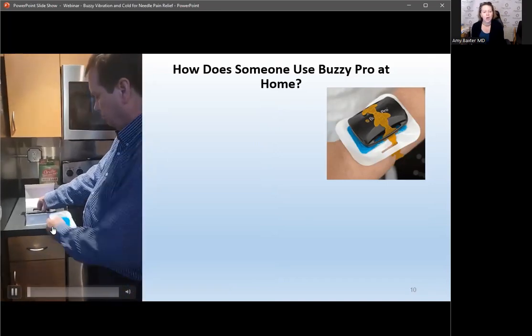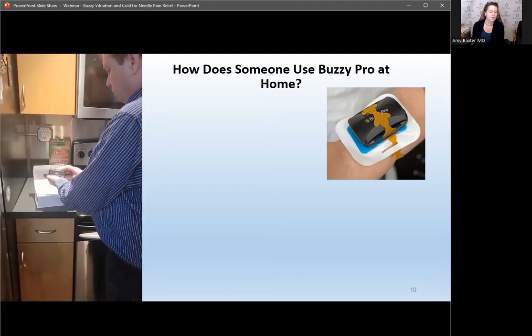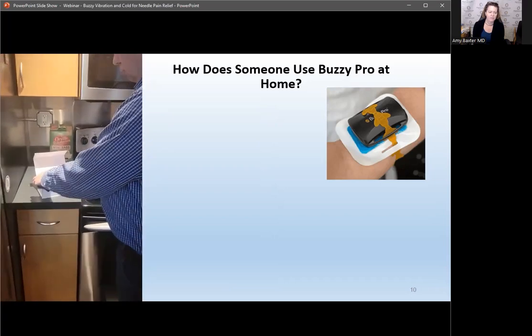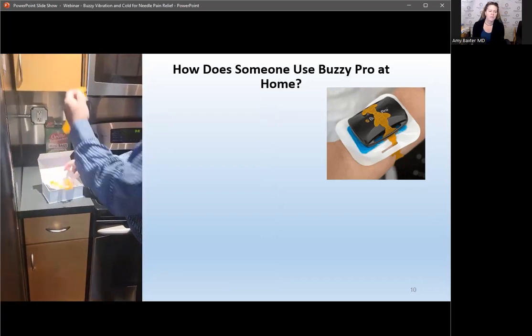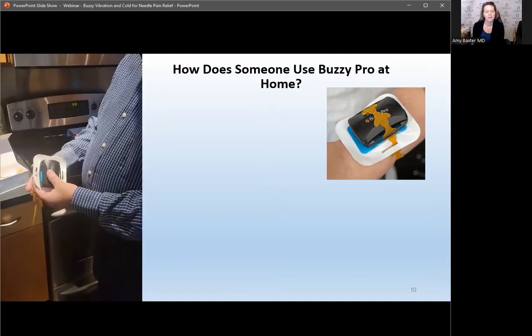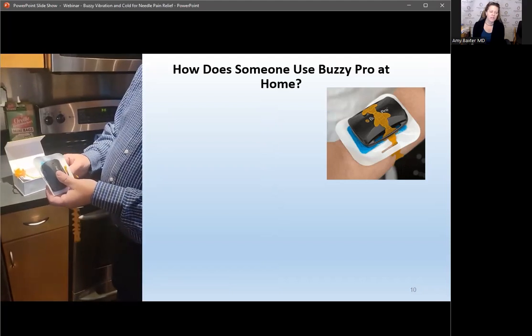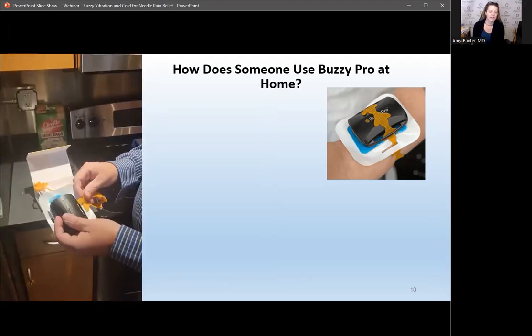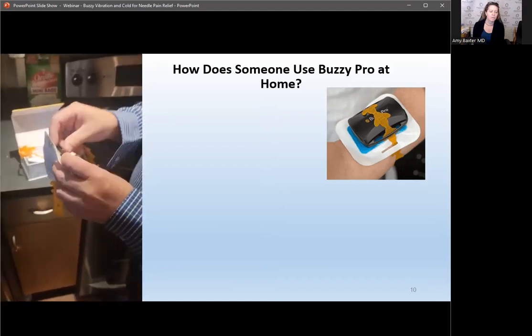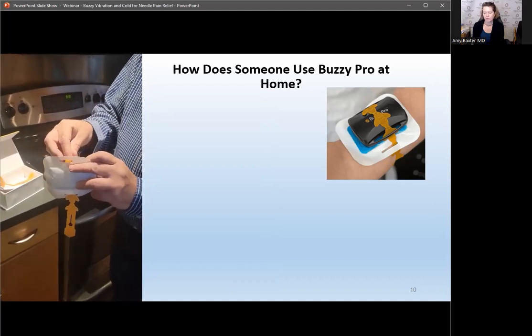Now, so it's at home using the new strap. So what someone would do is they're not going to keep the Buzzy in the freezer. Buzzy Pro is kept elsewhere. They're going to get the long thing, and it has a hole in the end of it, so it sort of acts like a D-ring. So the blue side here, you can see it's being threaded through the ice pack, through the Buzzy Pro, and there are very, very large areas between the ribs to put that through.